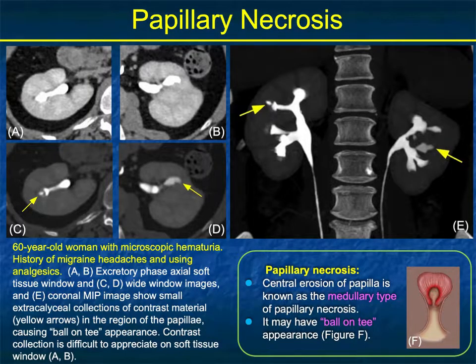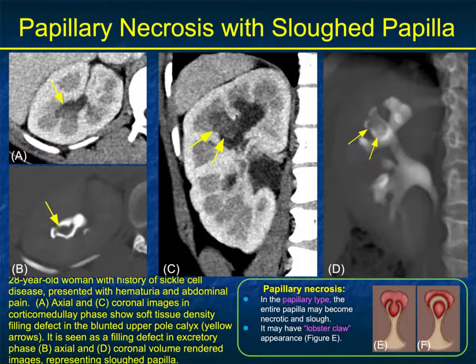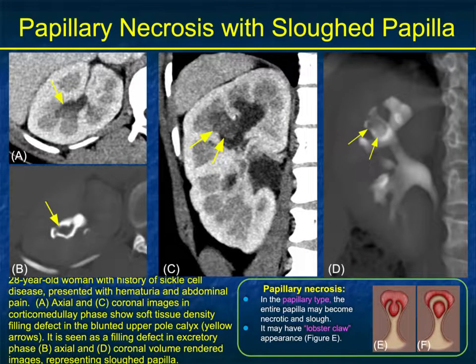Here's a nice example of a patient with microscopic hematuria. Looking at the upper images you don't see much, but when you widen the windows you see the changes of papillary necrosis — the ball-on-T appearance — and on MIP imaging it's much easier to see. A very important finding that is very easy to recognize once you know what to look for. With papillary necrosis there can be sloughed papilla, as shown here — really easy to see and best appreciated on MIP imaging, where the destruction of the papilla is very nicely shown.